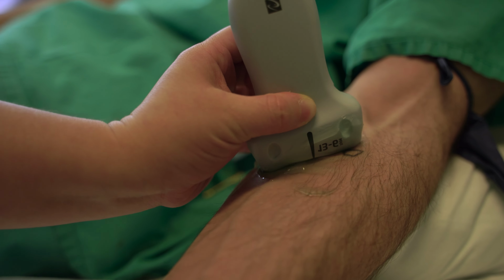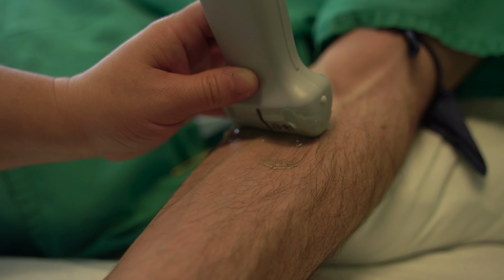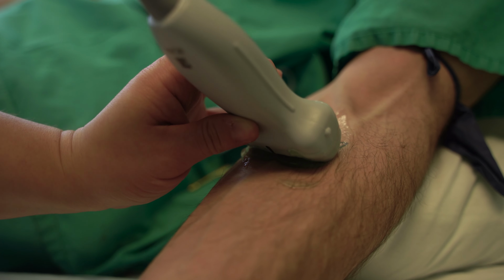Something to be aware of: the more stressed you are, the more pressure you may be applying as the procedure progresses. Now, alignment refers to where your probe is in relation to the structure you are trying to find and has relation to needling approach, which we'll talk about soon. Now, rotation is pretty self-explanatory. You might turn the probe to better orientate yourself. Tilt or angulation is one of the more important aspects of probe movement. You want to ensure that your probe is exactly 90 degrees to the structure that you're trying to visualize. Reason being, you'll get the best image when you've found the right tilt. Sliding then refers to when you're trying to trace or follow the path of a vessel or a nerve in order to find the bifurcations or any other anatomical waypoints.